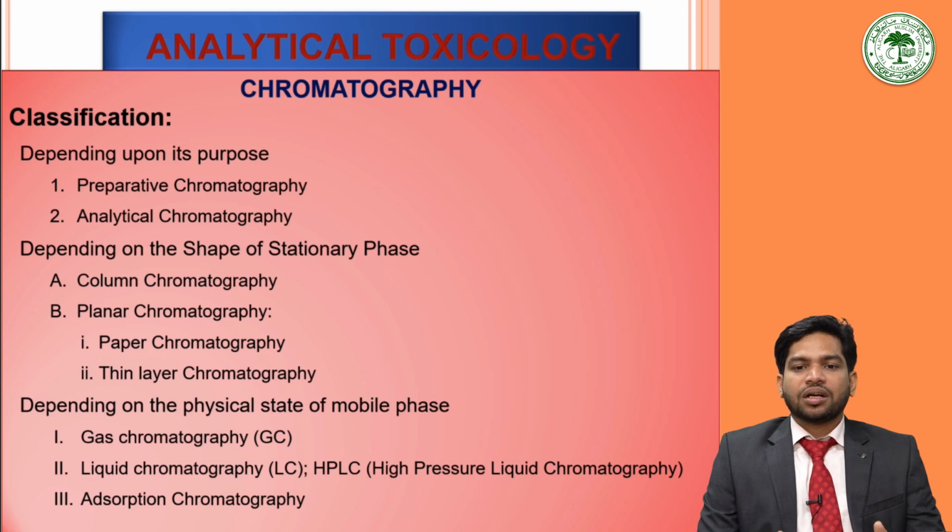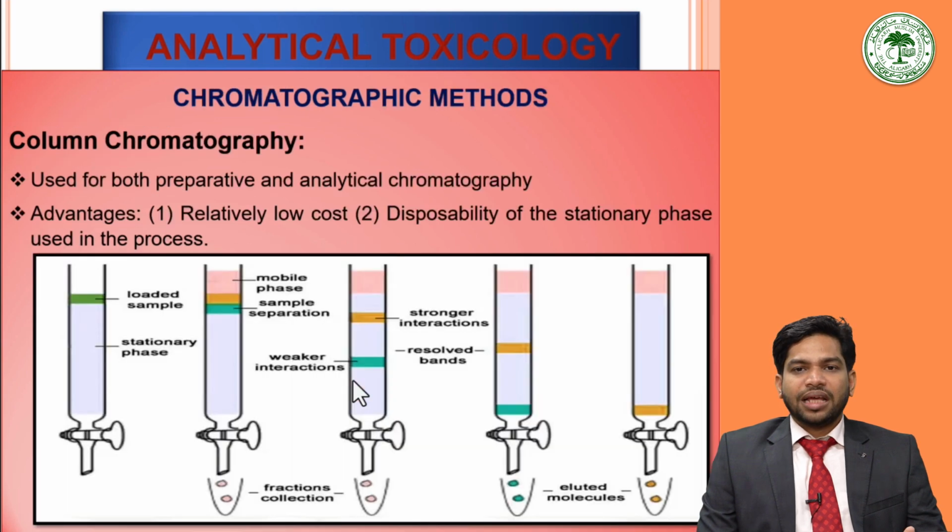As the separation occurs due to differential adsorption of the compounds on the solid stationary phase, it is also known as adsorption chromatography. Adsorption chromatography is one of the oldest types of chromatographic method. Then, coming to the individual chromatographic methods.